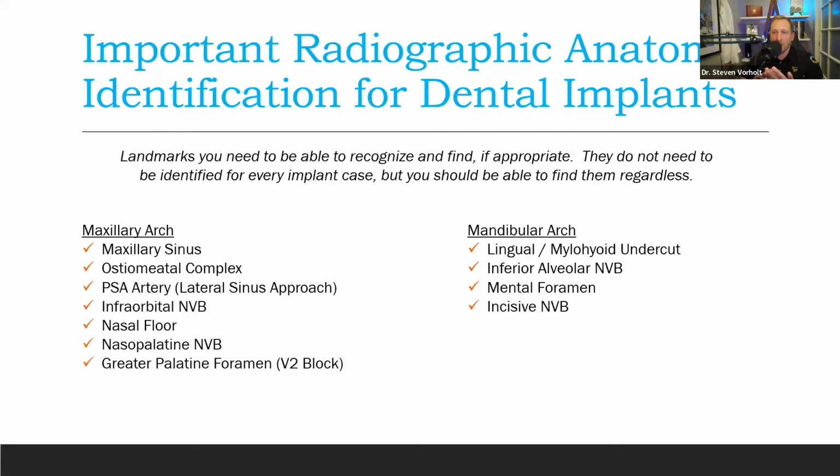I know I blew through how to read the CT really fast. There are a lot of great webinars. Like I said, Heidi Kohlfarber has some great ones on Henry Schein. She's an oral maxillofacial radiologist. She takes her time. There are a couple hour-long ones on there if you want to get more detailed into how to read these things, what to look for, lots of examples of pathology and whatnot. But these are the kind of things that I'm looking for in every read of a CT. And it just becomes second nature when you've done many, many of them.